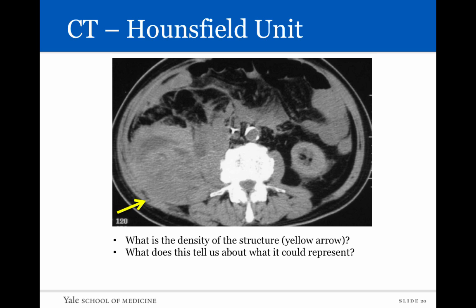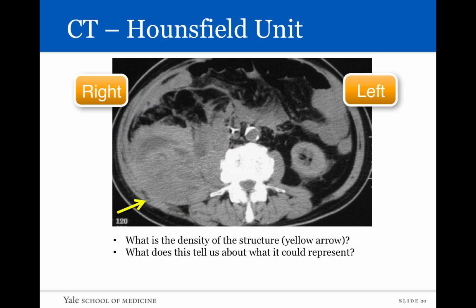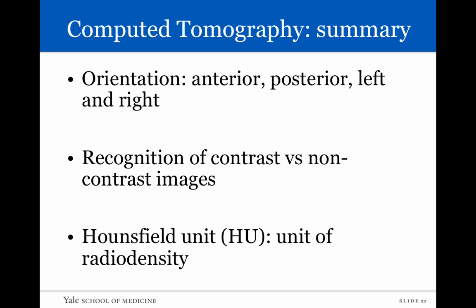To use this practically: here we have a CT scan with the patient lying on their back — right and left sides identified, and this is a non-contrast CT. We see a large structure that shouldn't be there. Looking at it, it appears rather bright despite no contrast being given. We can measure its Hounsfield unit, which comes back as 50, and that allows us to understand this is probably a blood product — a large hematoma.